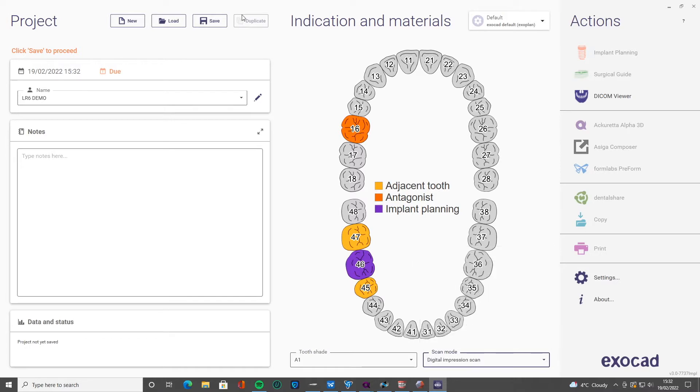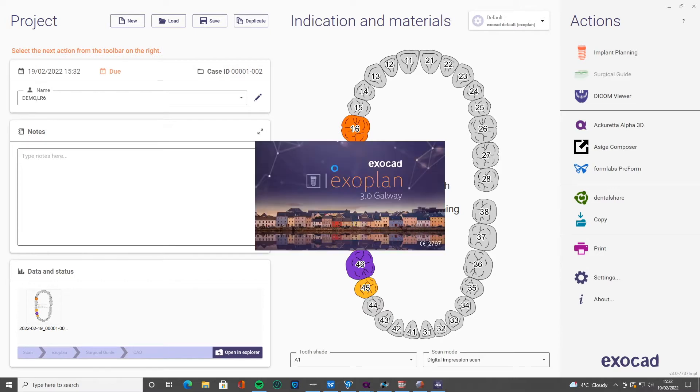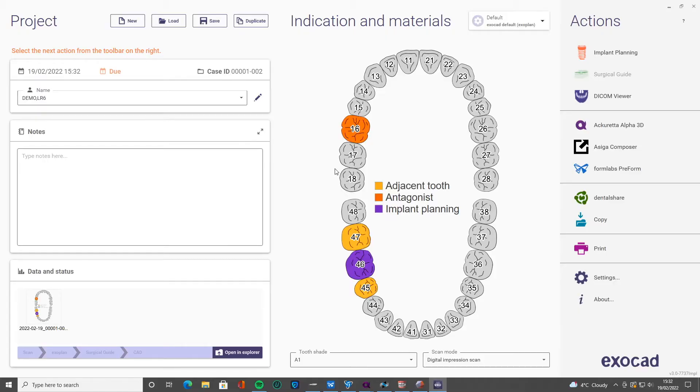So we've set this up, we're planning the low right six, we've planned the adjacent teeth, I've planned the opposing tooth, so I'm going to bring in the opposing dentition as well. We've clicked implant planning and it's loading up ExaPlan. So here we go.